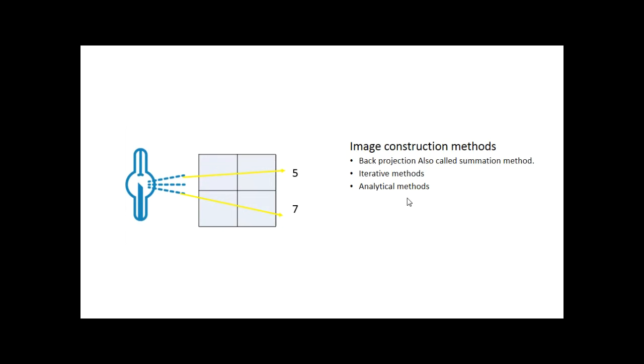And then the CT tube will rotate, let's say for 90 degrees. We'll not mention the 360 degrees, just 90 degrees, and make another exposure at the same matrix, but from a different angle. So we'll get another exposure value. It's a cumulative of these values.